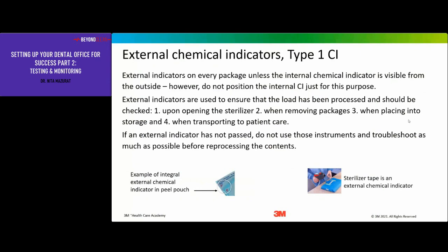It's just one of those things that you do bang, bang, bang, bang, bang. I get more calls from people who have said, what do we do? Somebody loaded the sterilizer, but they didn't start it. Somebody else came along thinking that it was finished, it was done, it was cool, and they unloaded and placed those packages into storage.